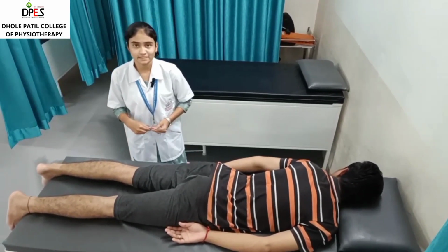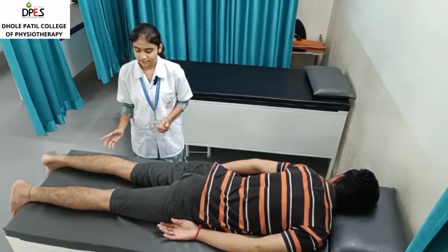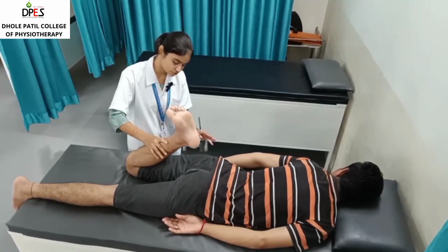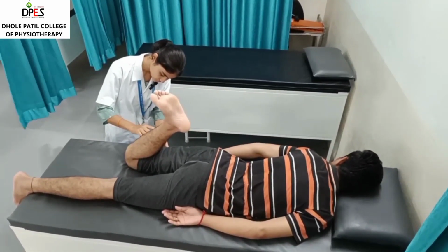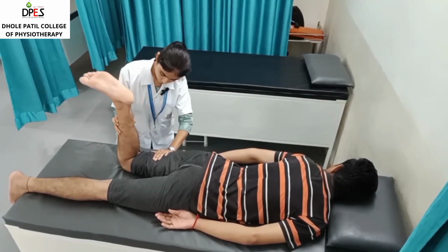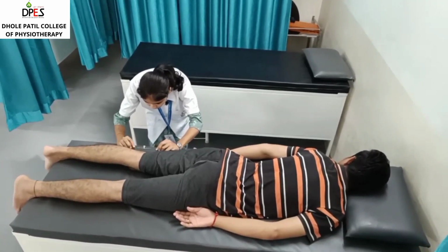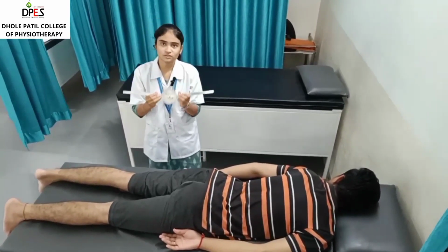Now let's see for the extension. The extension is measured in the same position. We just have to take the knee to the full flexed position, and then we will bring it to the neutral position. Just hold this position, sir. So as we can see, the patient is having full range of motion.